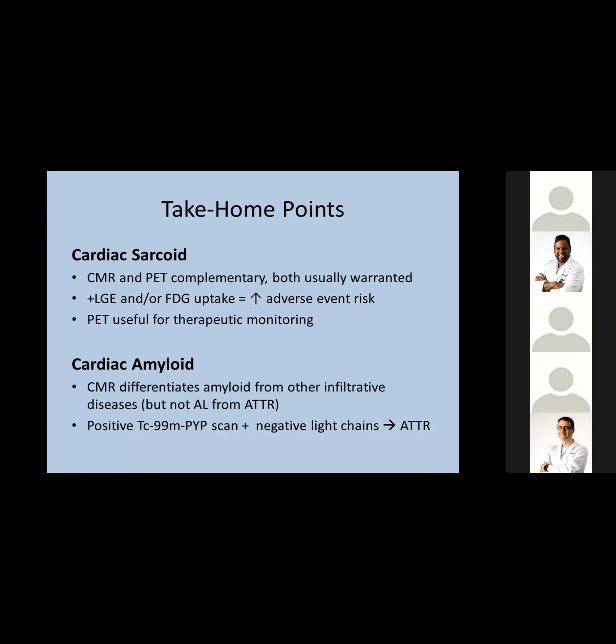Okay, and that's basically all I had. So the key things just to emphasize are that in sarcoid, CMR and PET are really complementary modalities, and in most cases they're both useful, especially in initial staging of disease.